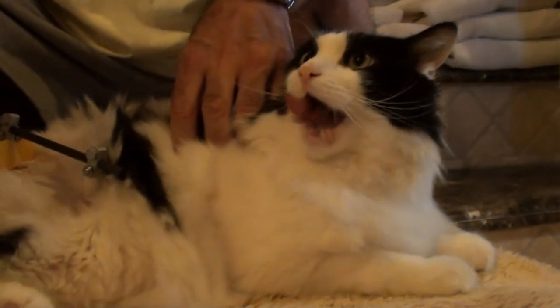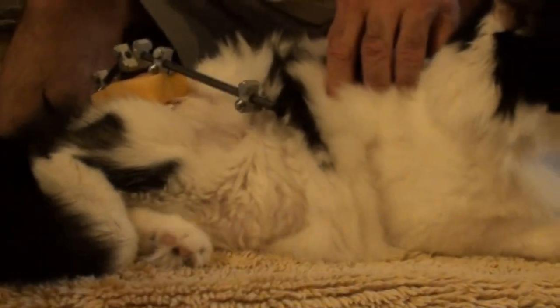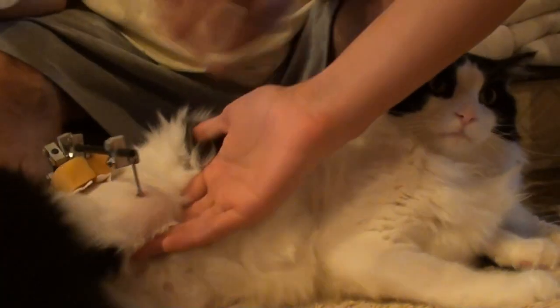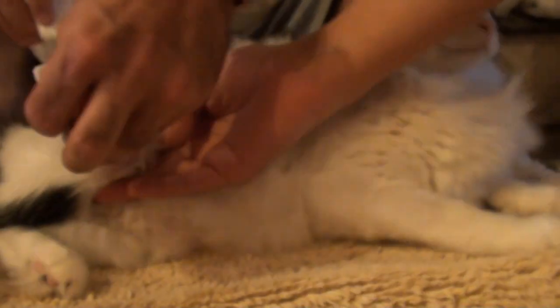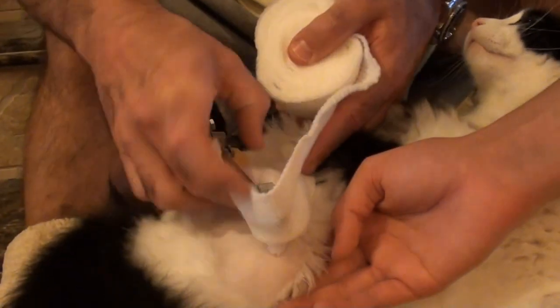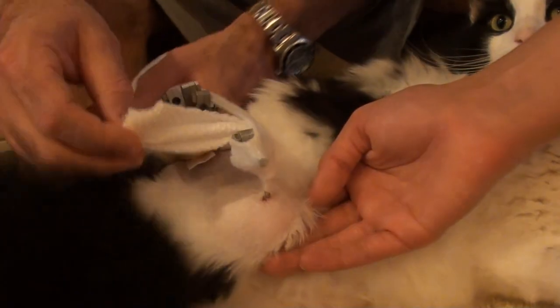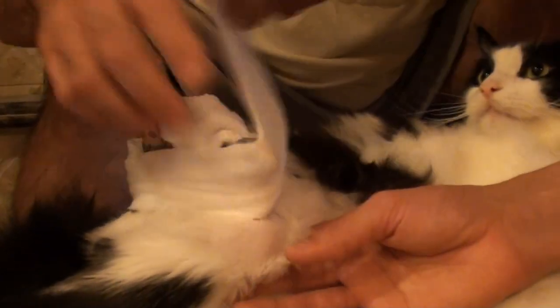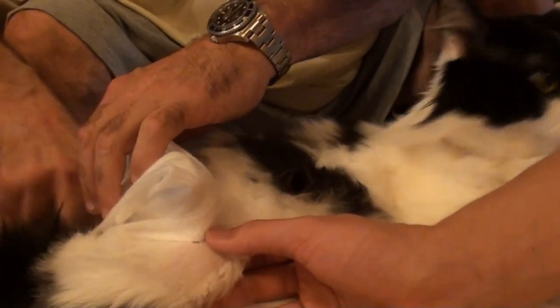Surgery time. I need cotton first. Here's his little kit right here with his stuff. Someone's going to have to kind of hold him. Just hold that up. We're going to go around and tie it around his pins here. Let me get a pair of scissors. See how that goes up like that? We'll bring that around. Put some gauze on kitty's leg — we have to get up and underneath there so any seepage gets taken care of. Can you make sure that it goes on the bottom? Then we'll just cross wrap them like this.